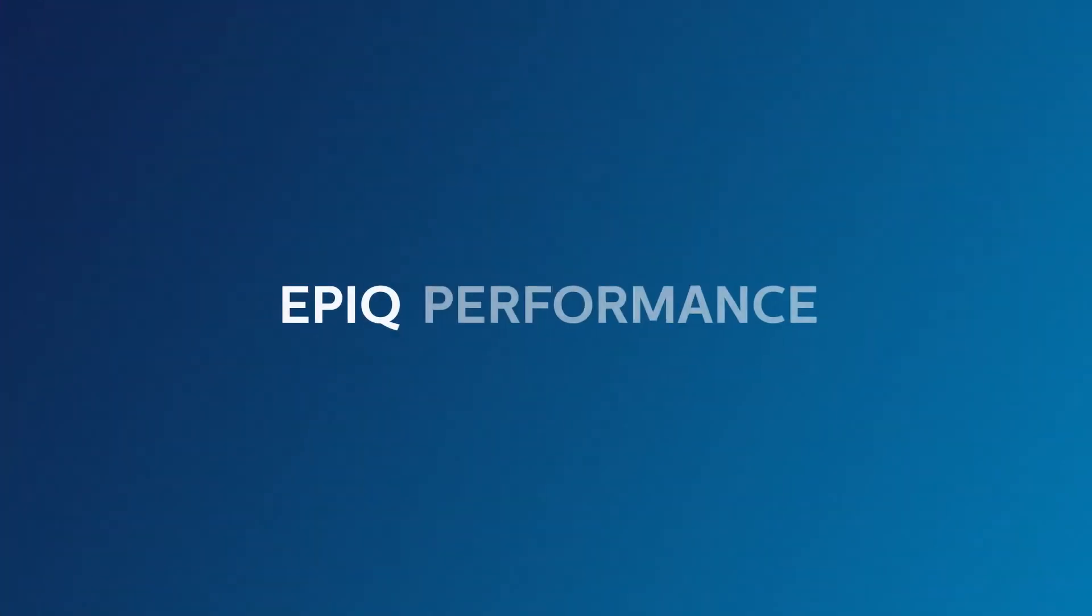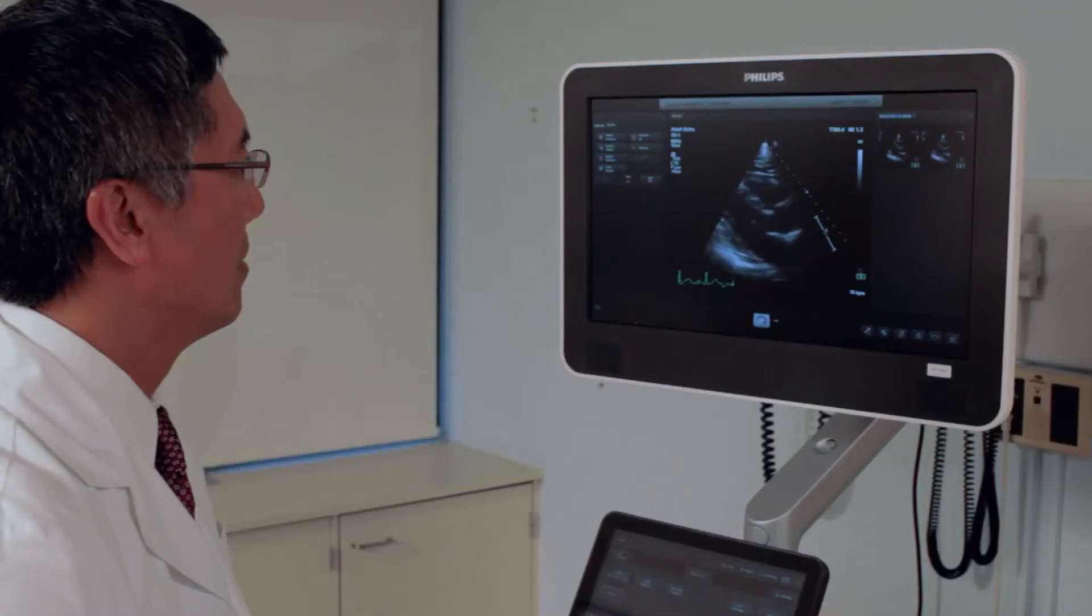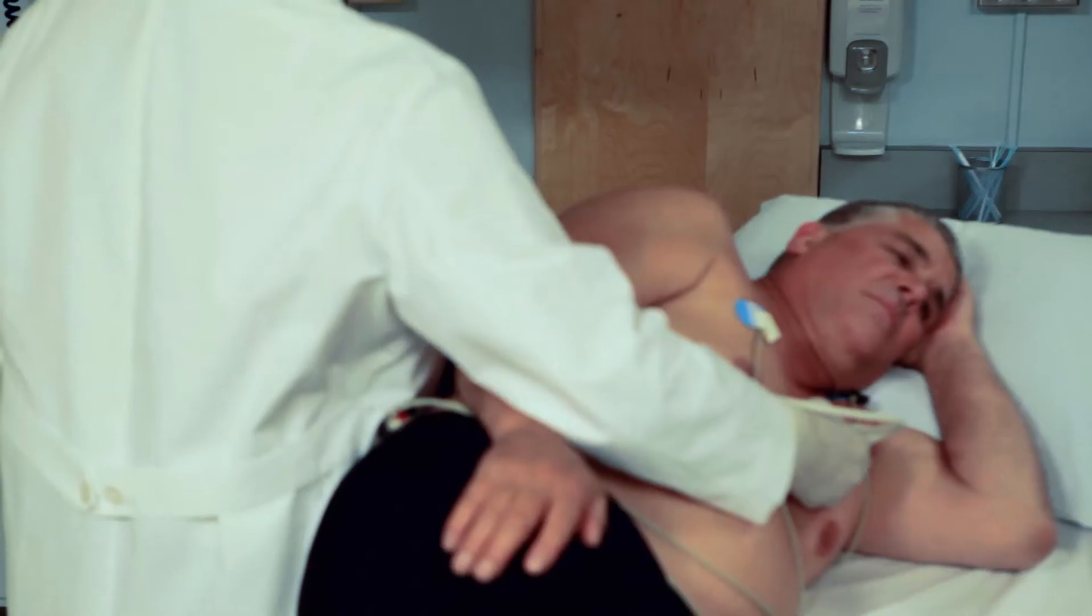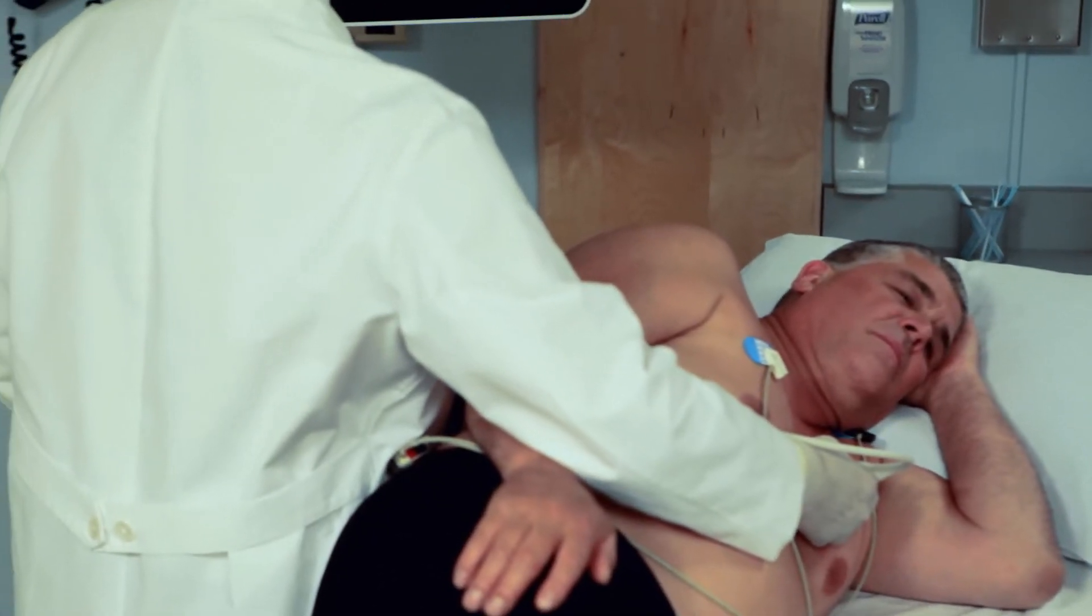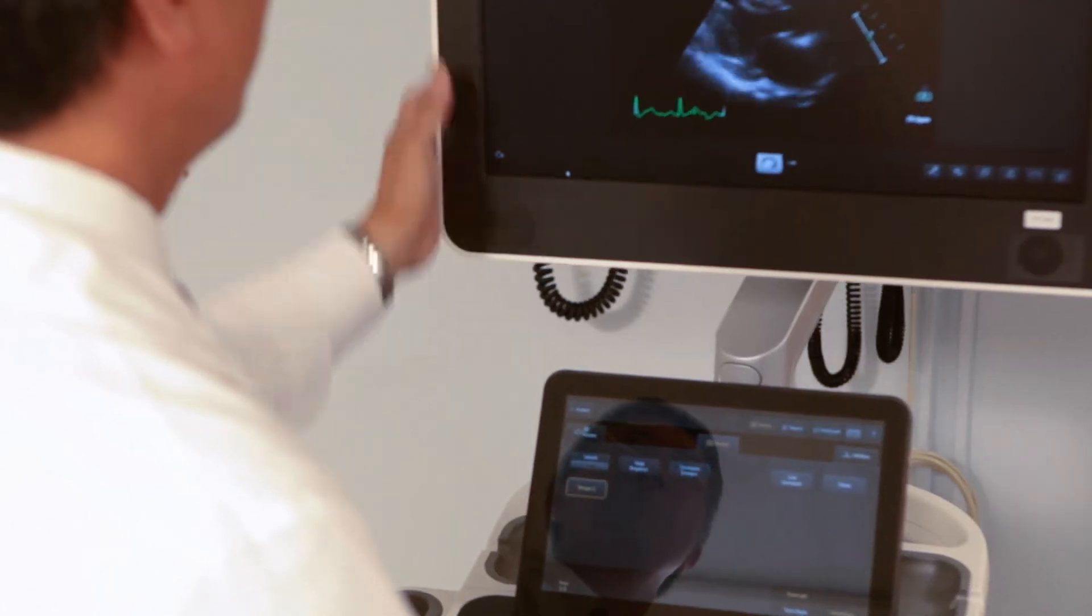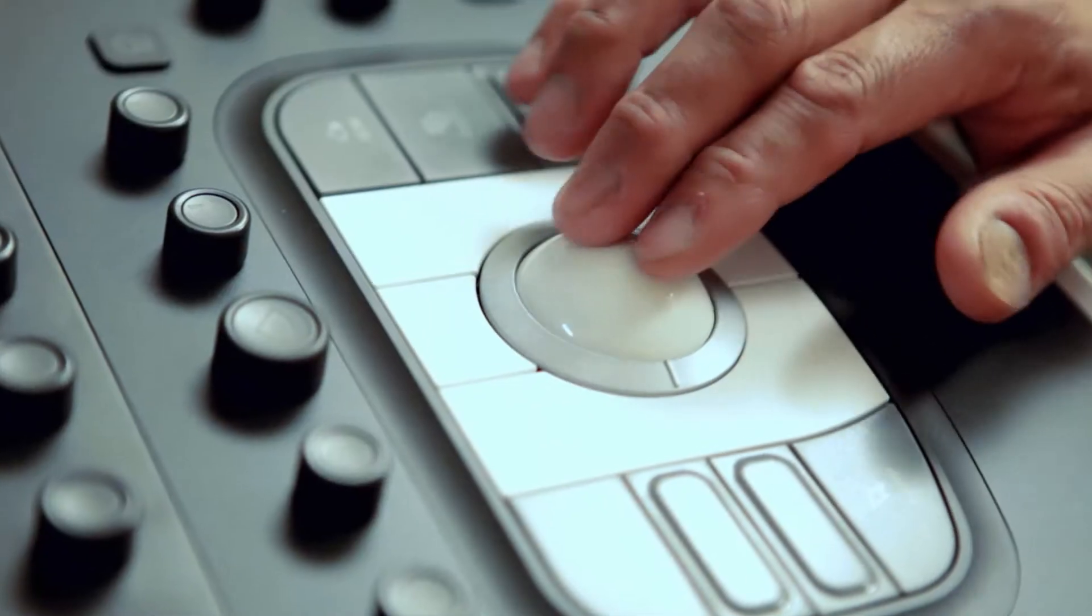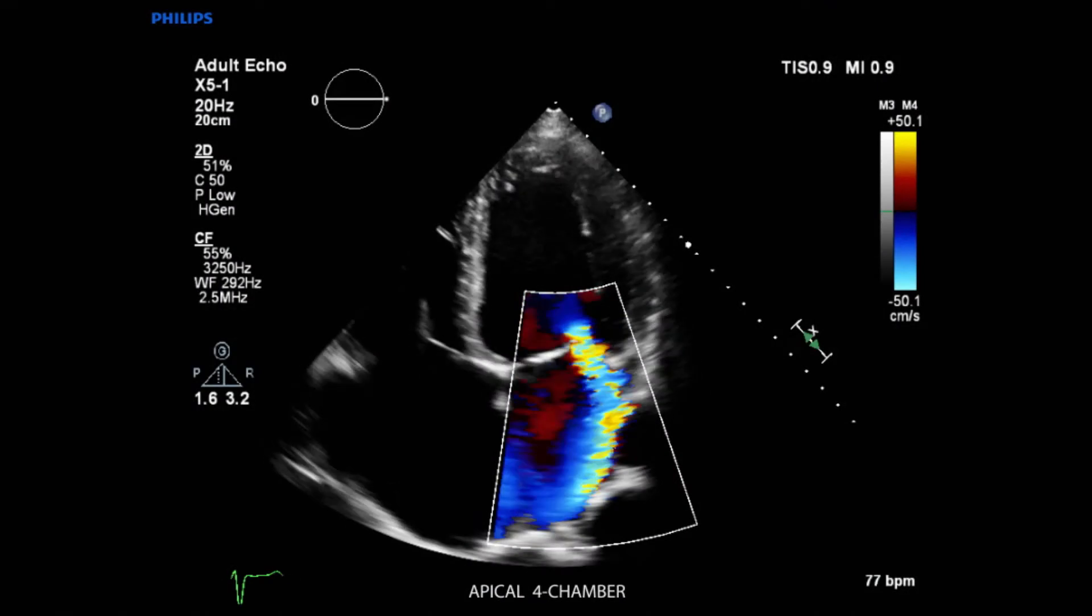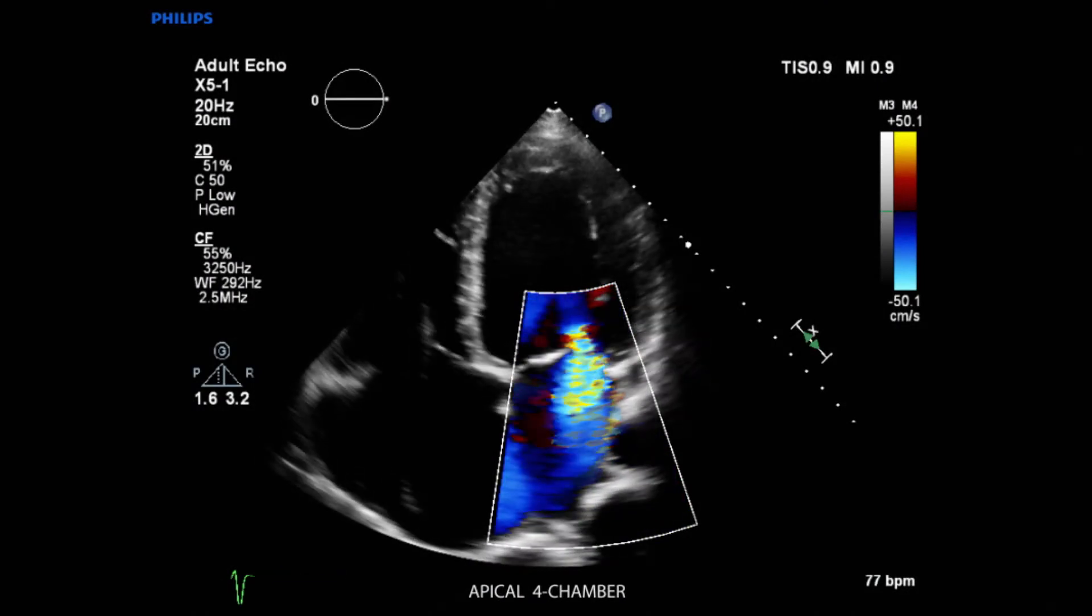The Philips proprietary N-Sight imaging architecture introduces a totally new approach to forming exceptional ultrasound images. Unlike conventional systems that form the image line by line, N-Sight creates images with optimal resolution, down to the pixel level, in real time.